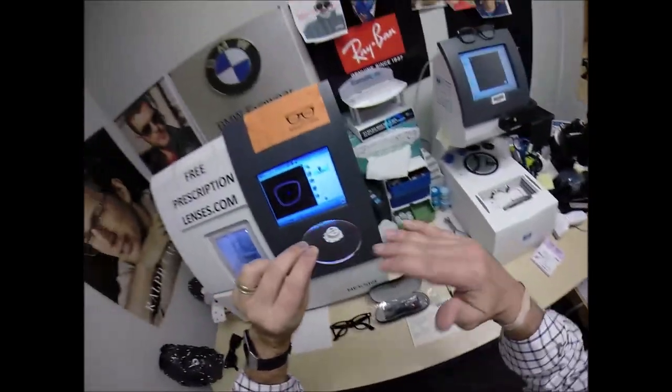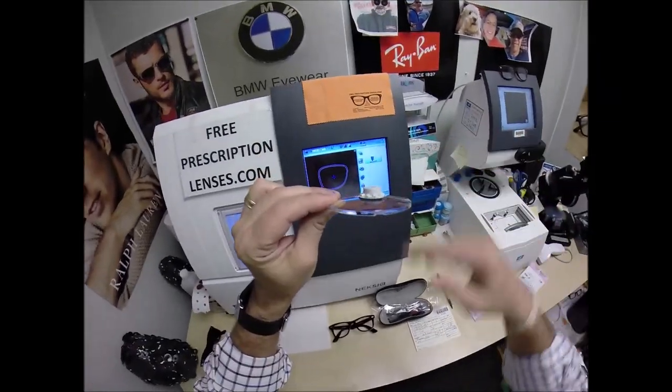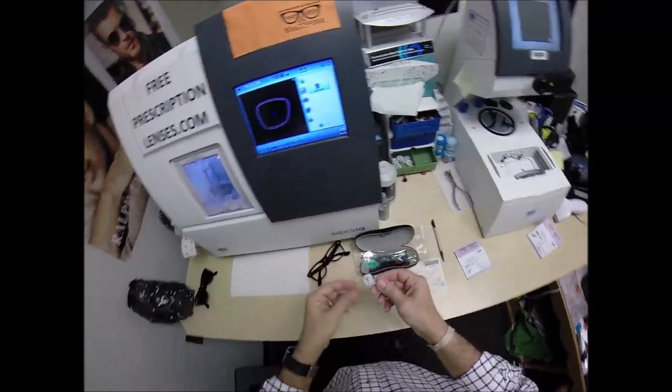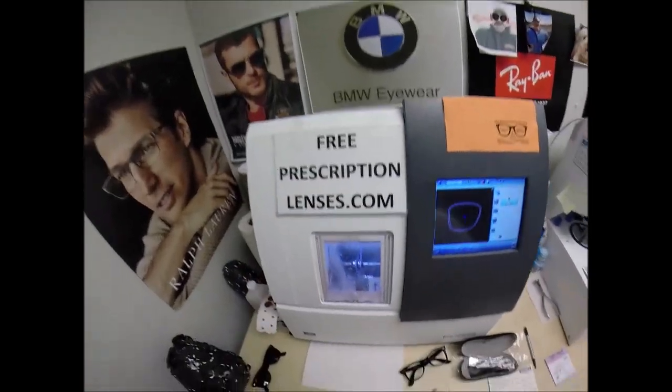When you buy glasses from people online they charge you for the prescription — that's no bueno. If you want to upgrade to thinner, lighter, unbreakable polycarbonate, they charge you a fee — that is double no bueno. And if you want aspheric lenses — flatter front curvature, wider field of view, better cosmetic look — there's another fee for that, which is triple no bueno. So you're getting everyone else's top-tier lens for free every time you buy a frame from me.